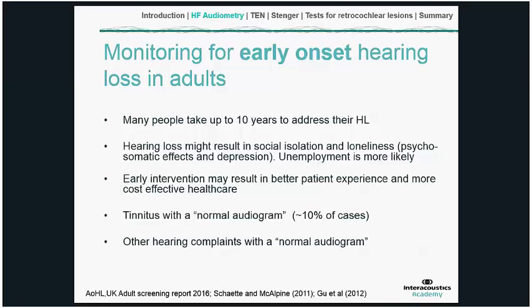But it may well be that they have triggered tinnitus because of a hearing loss in the higher frequencies that perhaps weren't routinely tested. That might explain a large proportion of that 10% group. And of course, again, that would lead to the option of perhaps more effective management, certainly counselling, as well as differential diagnosis of the tinnitus.